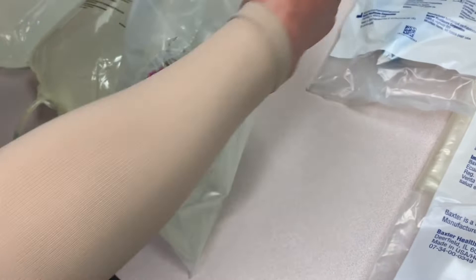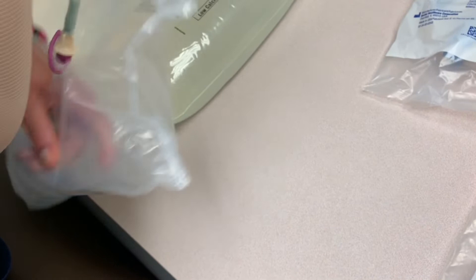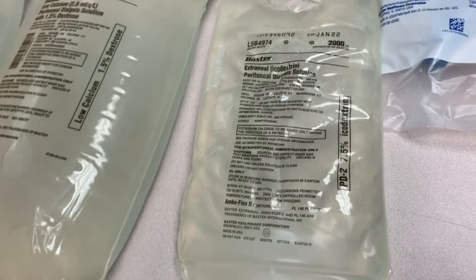You will be able to scan the MAR for the patient's name and the barcode there for each solution. This is Extraneal — it is made out of starch instead of dextrose, so it has its own special line when it comes to the cycler.